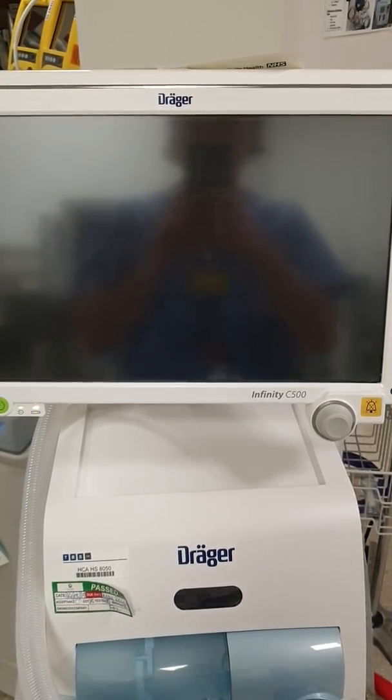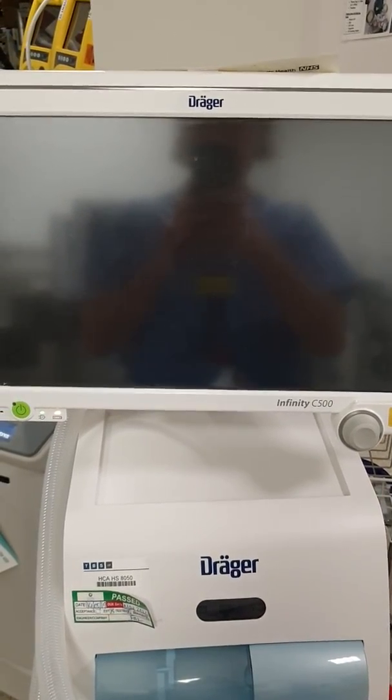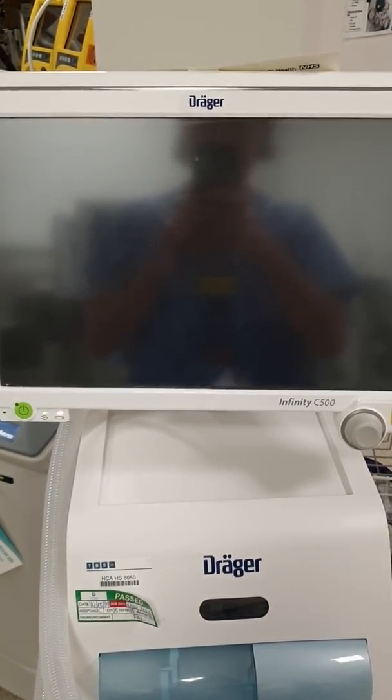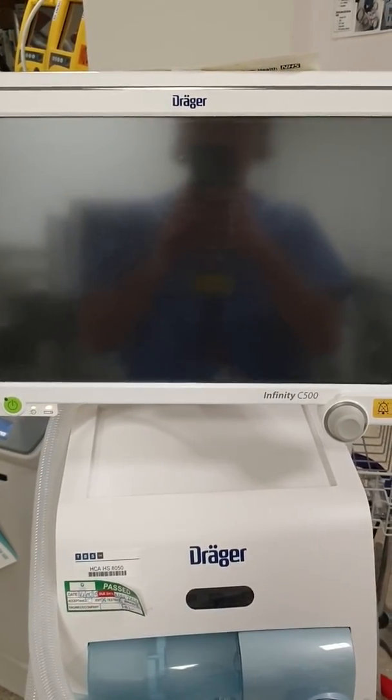Hi guys, this is Vlad from the tech team. Just a quick video guide on how to set up and prepare this new Draga Infinity for patient use.